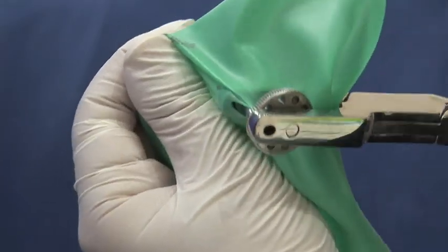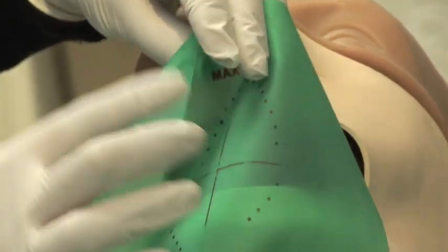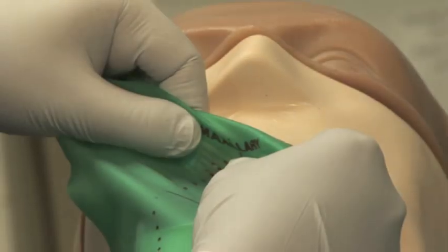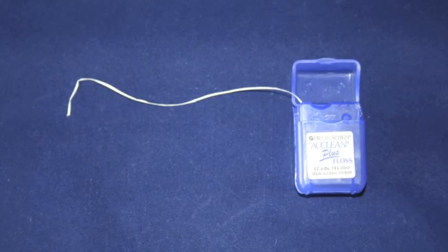Align the hole with the marking on the rubber dam and press down, making sure the punch goes all the way through the dam. The rubber dam is matte on one side and shiny on the other — the matte side should be facing up.